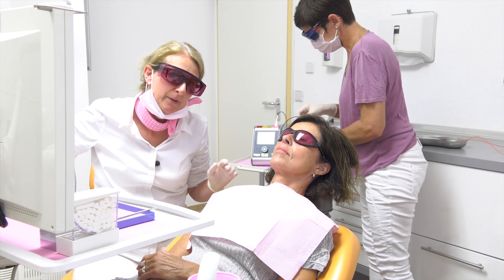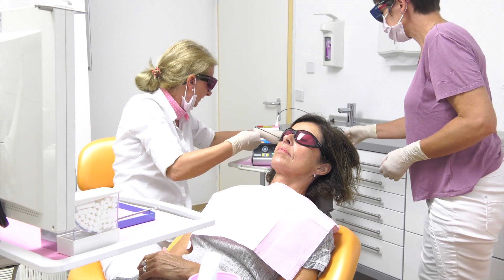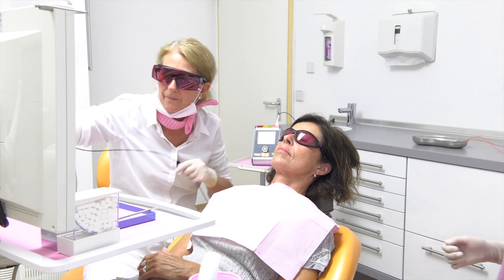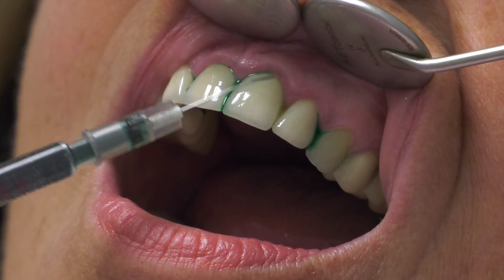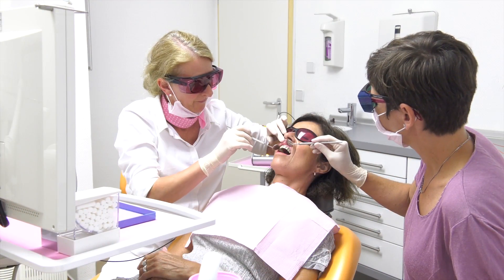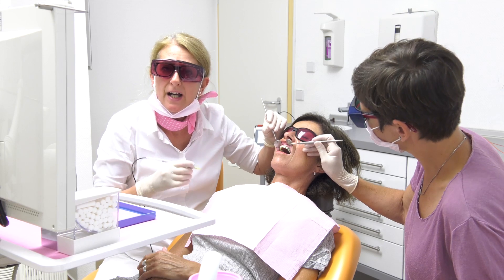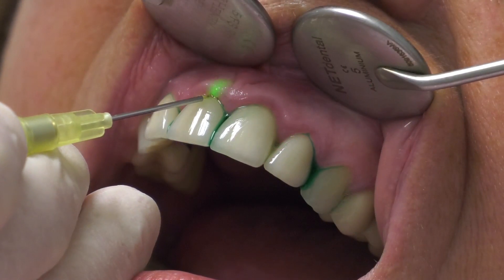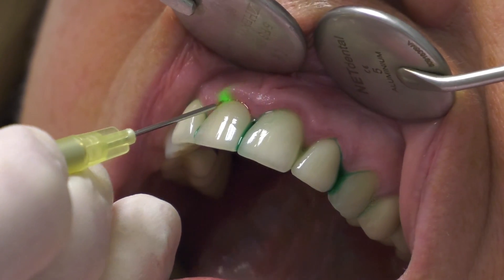Now we take the bulb fibre. Of course we put on fresh colour at the gingiva. Now we take our fibre and we move the fibre under the gingiva like this, also for 10 seconds.